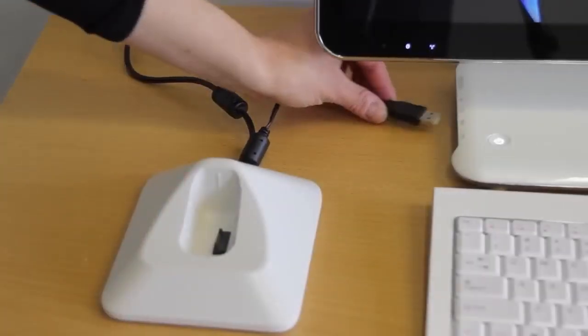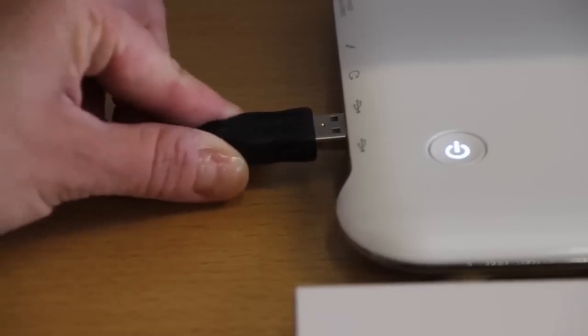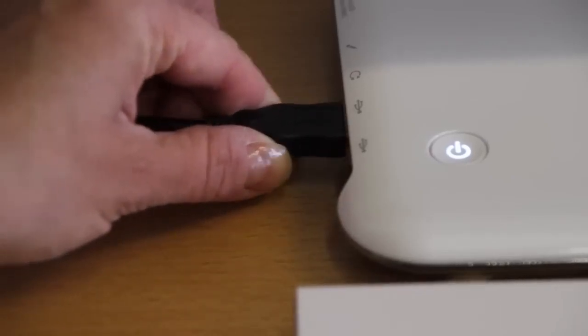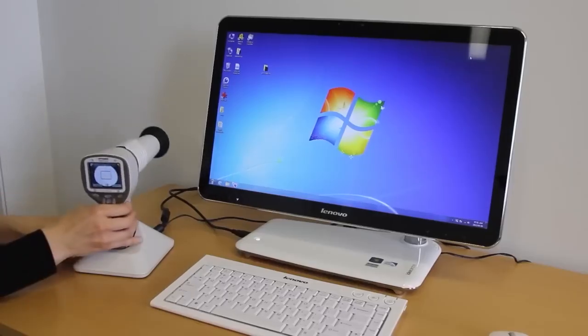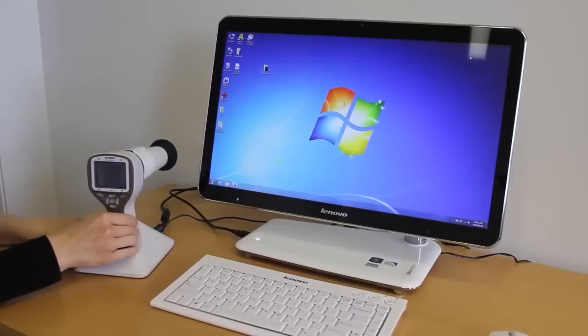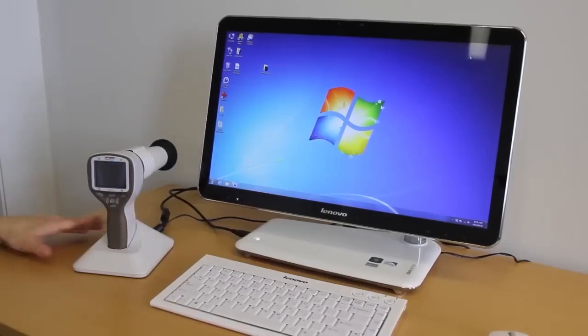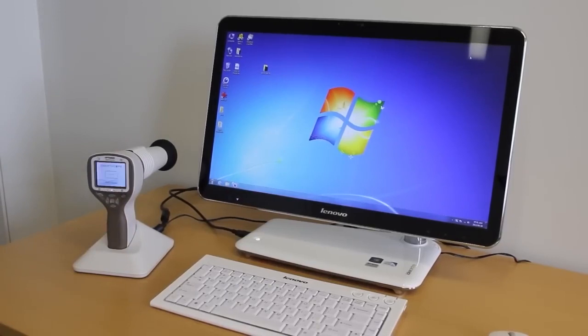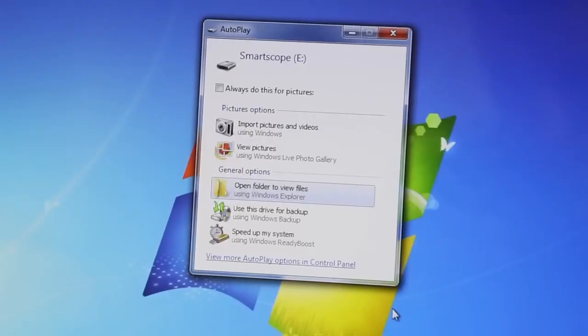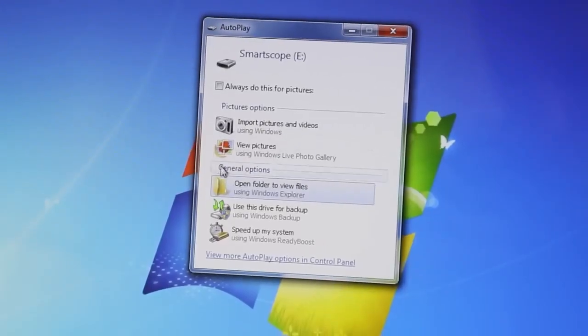Images are uploaded to a computer by placing the SmartScope in its cradle. Image transfer works through a USB connection in a similar way to any other digital camera.